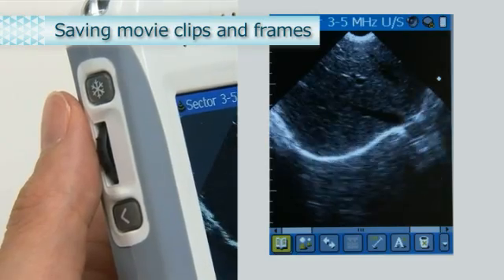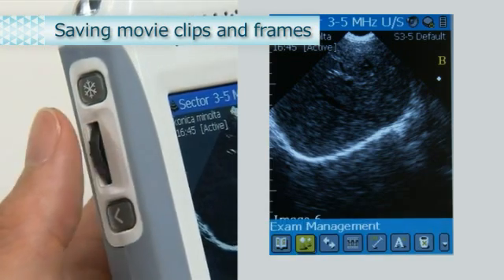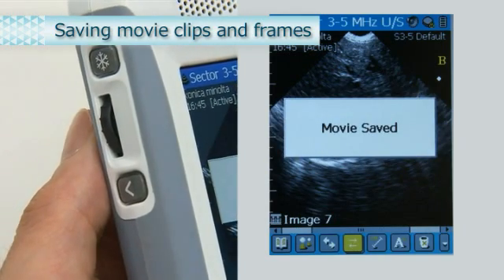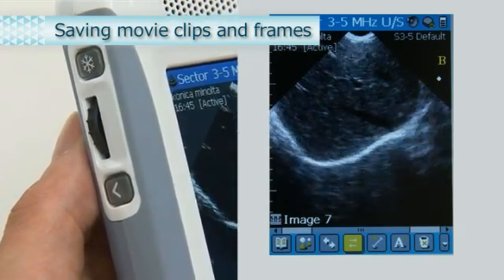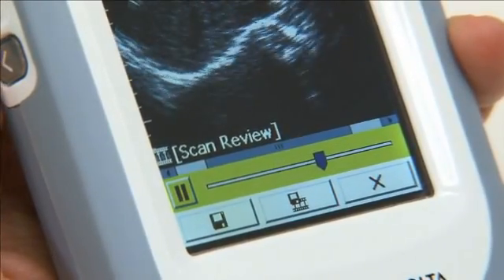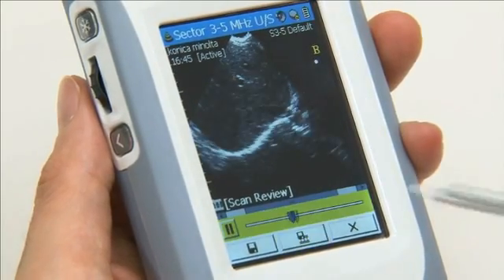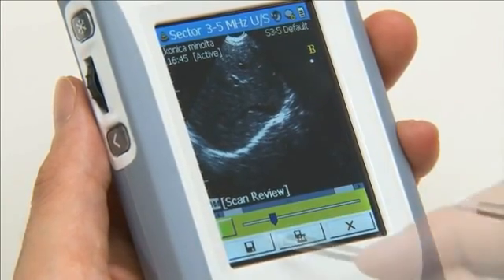To save a scanned image or movie, press the Scan button. From the toolbar, select the movie clip icon. A pop-up menu appears. If you select Save as Movie Clip, the movie from before the image was frozen is saved and played back immediately. To review the movie, select Enter Scan Review. To save the movie, select the Save Movie icon. To save a still image from the movie, stop the movie at the desired frame and select the Save Single Frame icon.